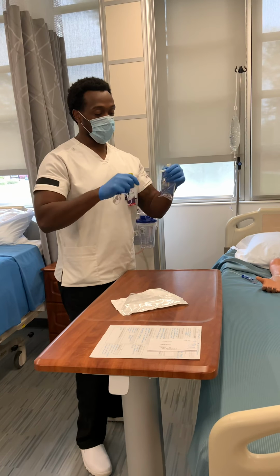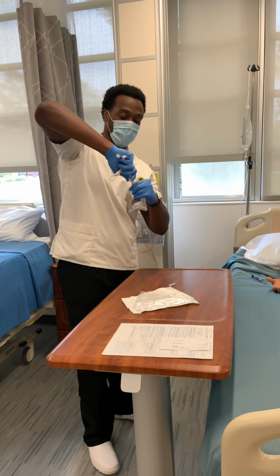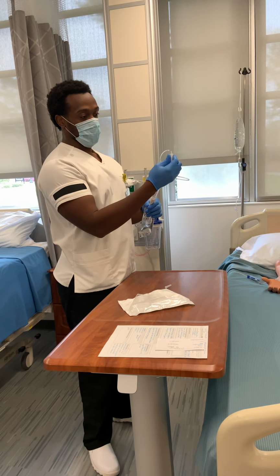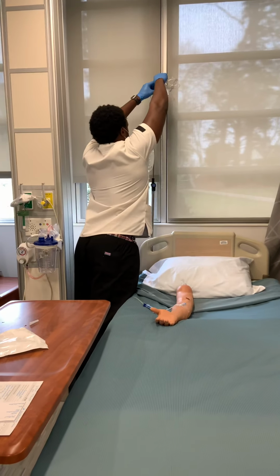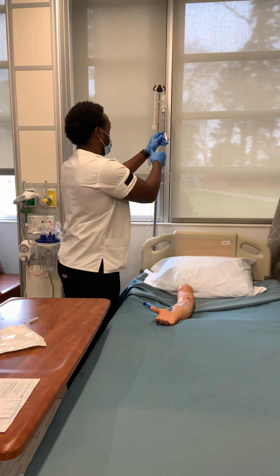I would take out the tip, put this in, plunge all the way down, and make sure the roller clamp is in the off position. Hang it higher than the primary line.